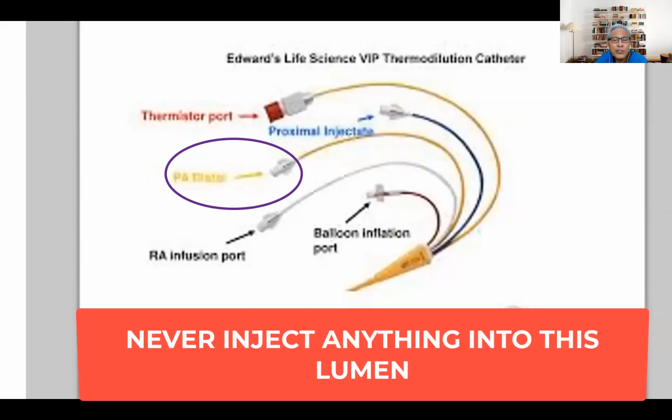There's one very important thing too. You should never inject anything into this lumen. No drips, no medications, no fluids ever. This is going directly into the pulmonary artery.